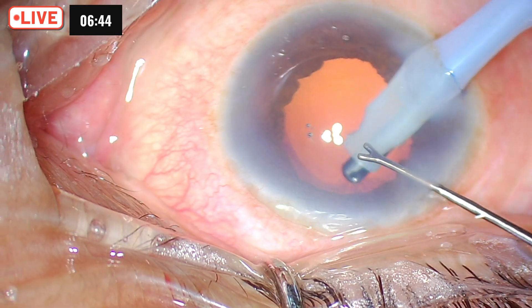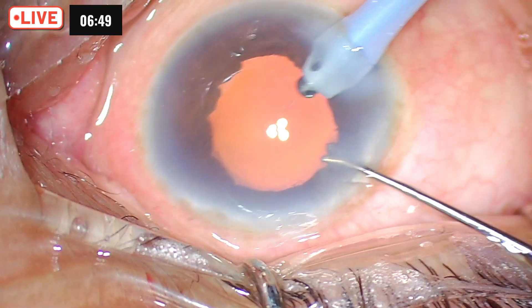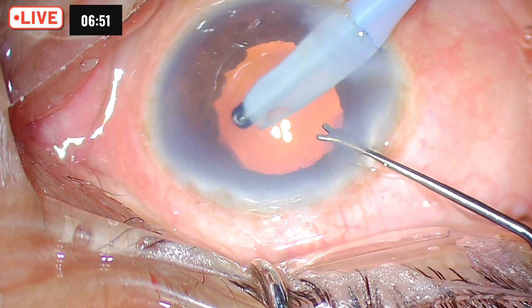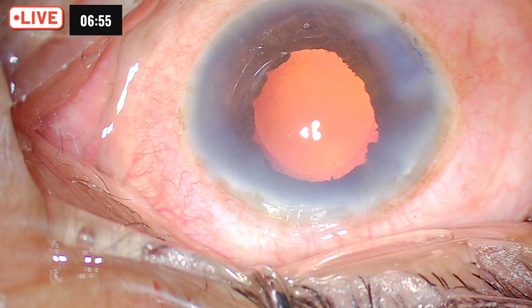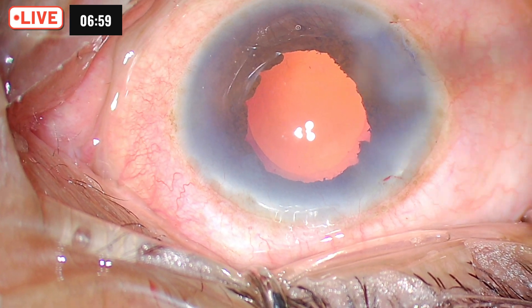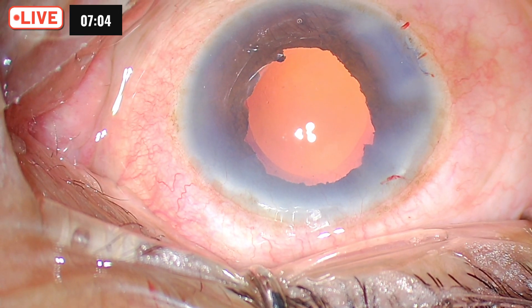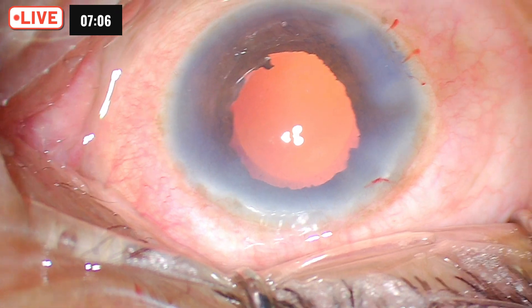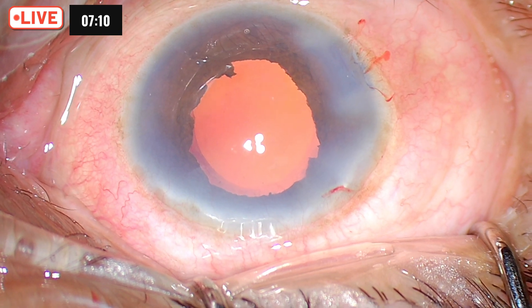As I keep pointing out, a good surgery is planned from the start — the first move decides the winner and the loser. We did plan everything accordingly: we made a good stretched pupiloplasty, did a sphincterotomy, made a large capsulorhexis, made sure we did not disturb the zonules, made a deep trench, coated the endothelium, and used a proper chopper. All these things in the end came to our rescue and the surgery went perfect.